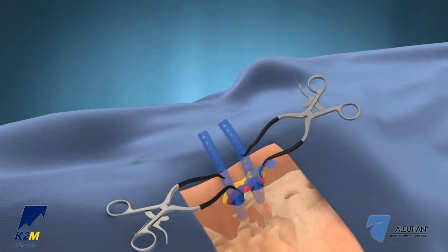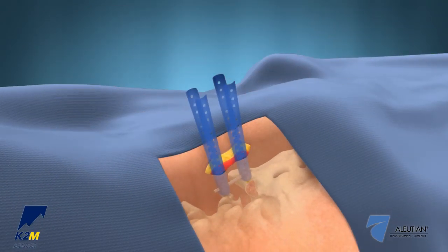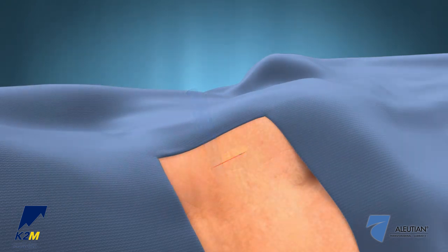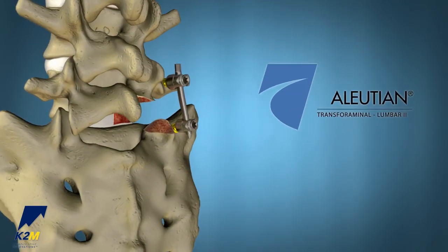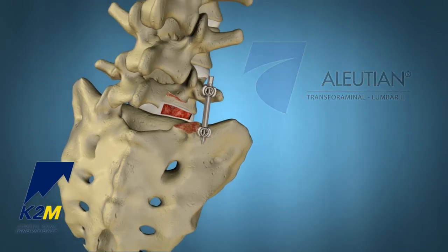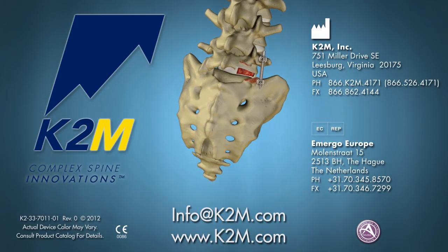Finally, use the retractor-extractor to remove the Serengeti retractors and perform a standard multi-layer wound closure. The ALEUTIAN Transforaminal Lumbar TLIF II Interbody System from K2M — Complex Spine Innovations.